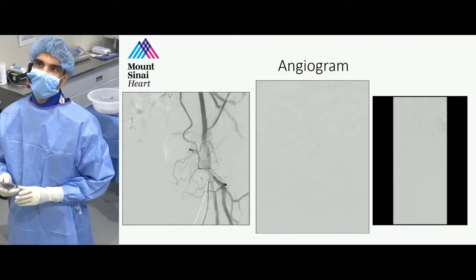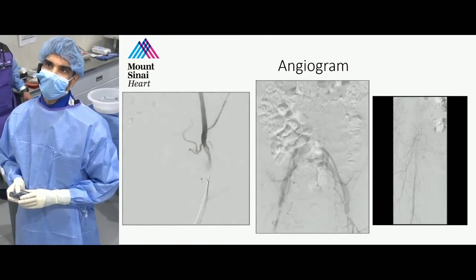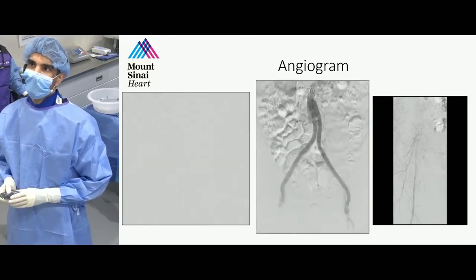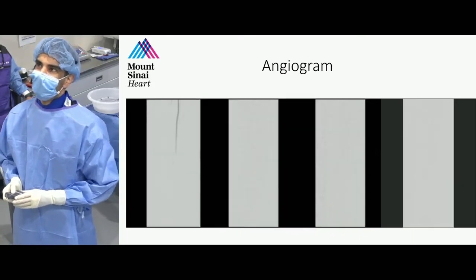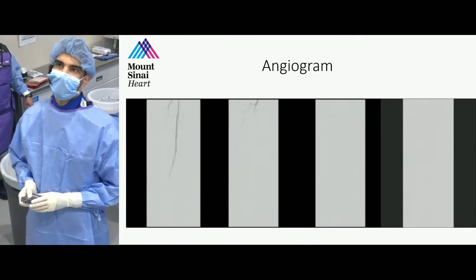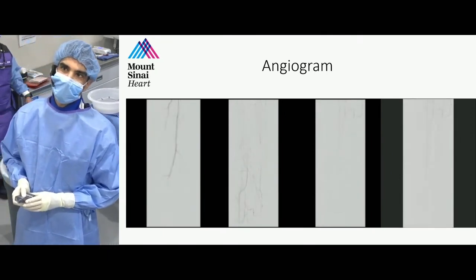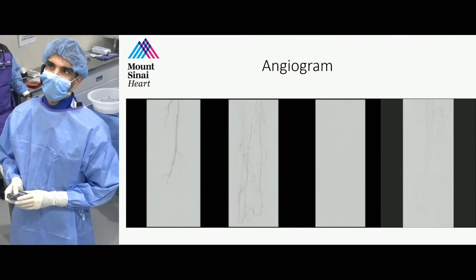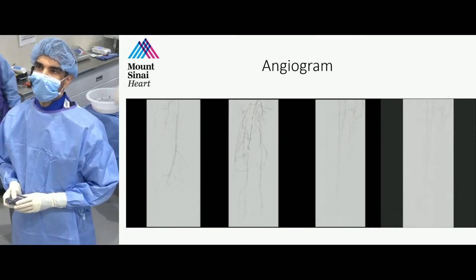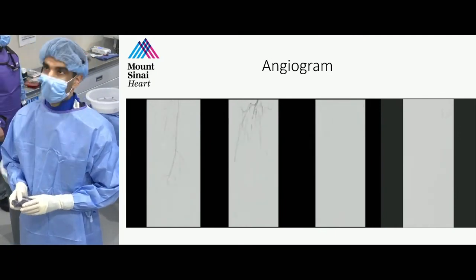This is her angiogram. Initially, we got access right below the bypass, got into the bypass. You can see a patent aortobifemoral bypass. Right at the touchdown of the bypass over there, you can see there's a heavily calcified common femoral lesion on the right side. The SFA proximal to mid really looks okay. It's really the popliteal. You have multiple segments of short CTOs and really a one vessel runoff with an AT going all the way down to the foot over here.